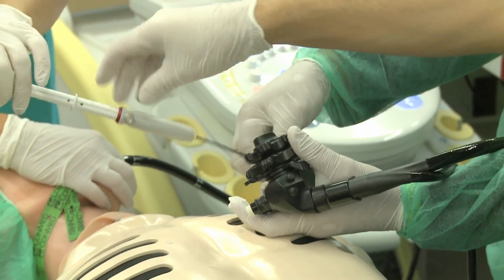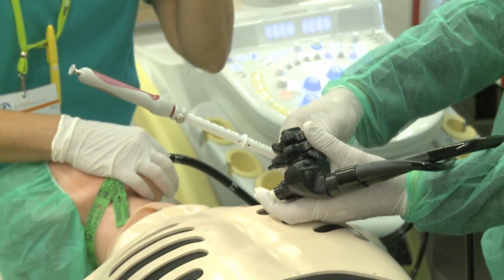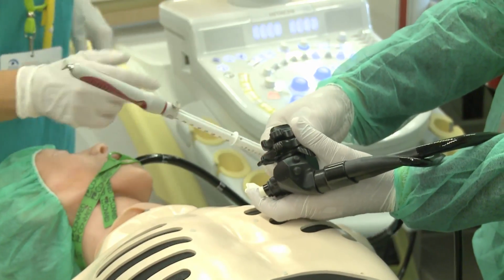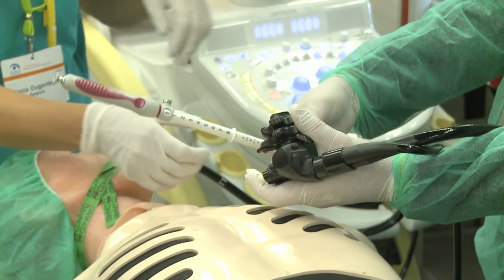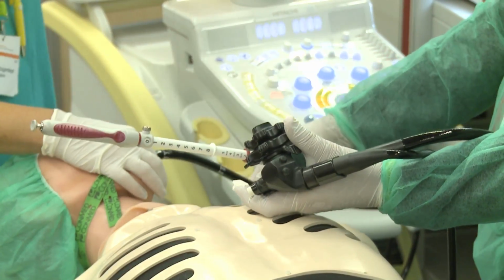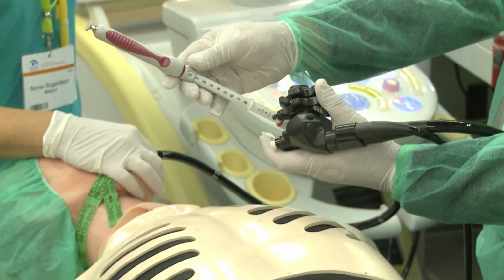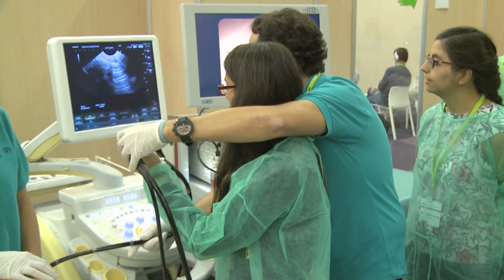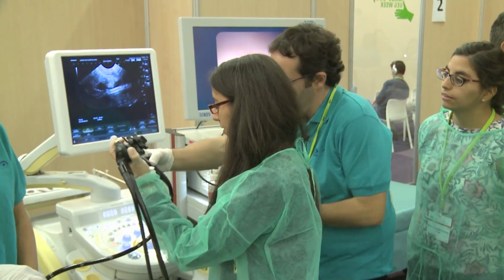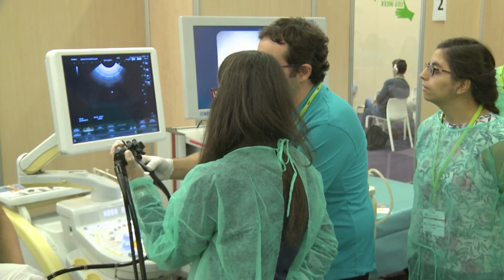The most difficult part of EUS is imaging, not the technical part. Is it diagnosing lesions? Yes. If you do not diagnose the lesion, you will never be able to biopsy it. So the most important part is to learn to do an EUS, and then you can learn to do an FNA. And if you go, we can have a lesion here. Aspirate all the time.